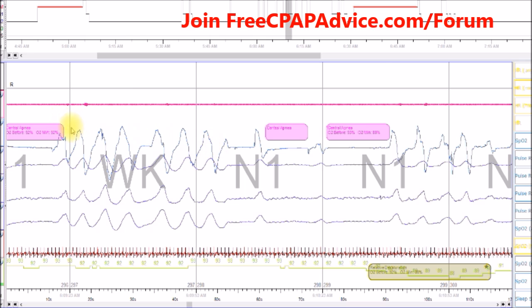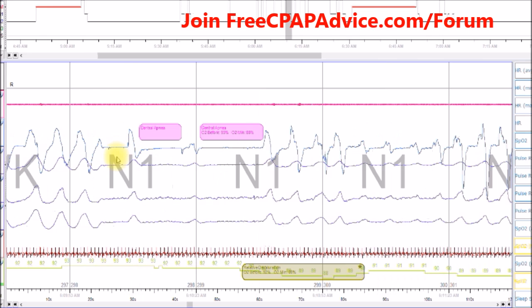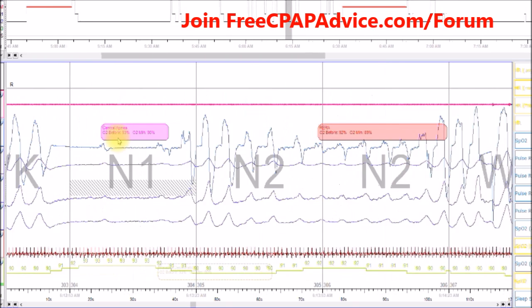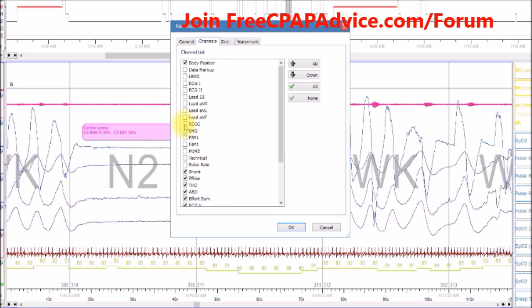If you see smoother transitions - this is a slightly smoother transition, you can tell there's more normalized airflow - it's probably real. With SleepyHead it's super difficult to tell what's real or not because you don't have the benefit of EEG, but thankfully here we do have the benefit of EEG.